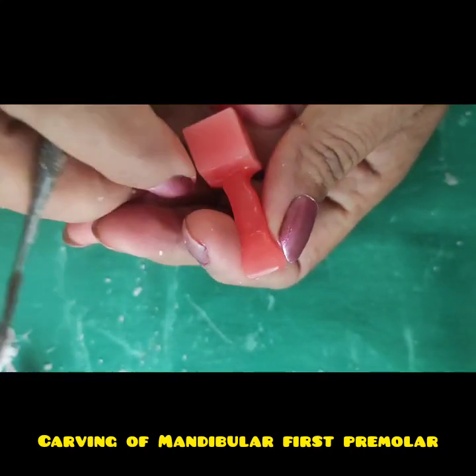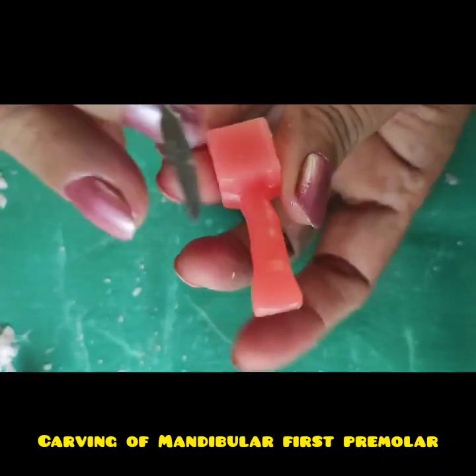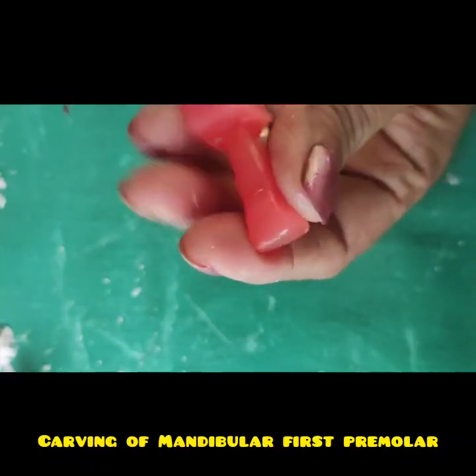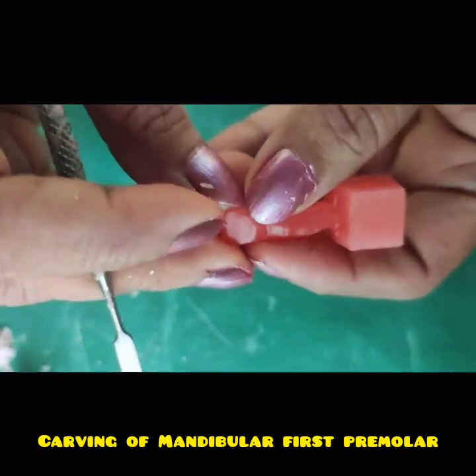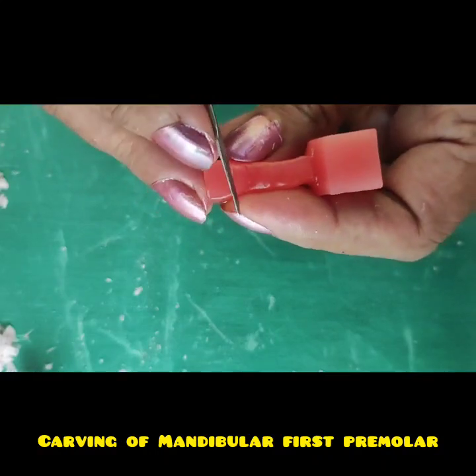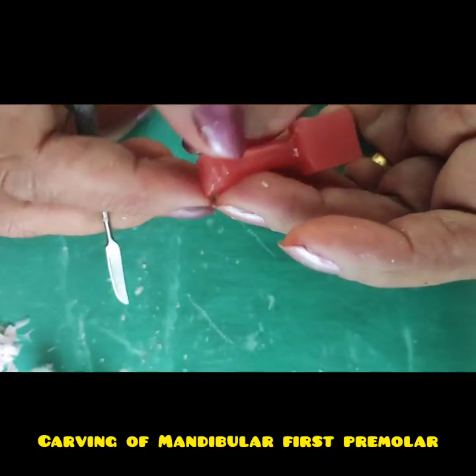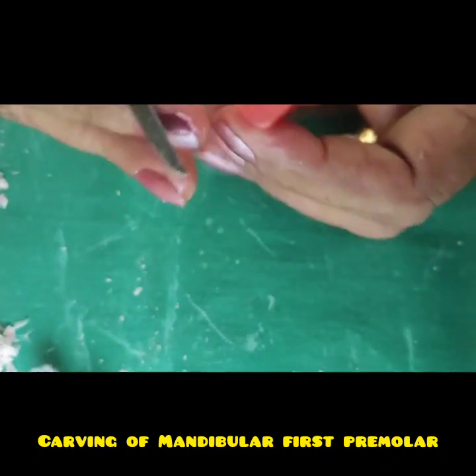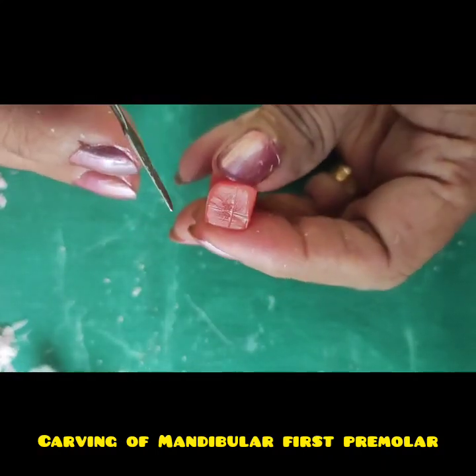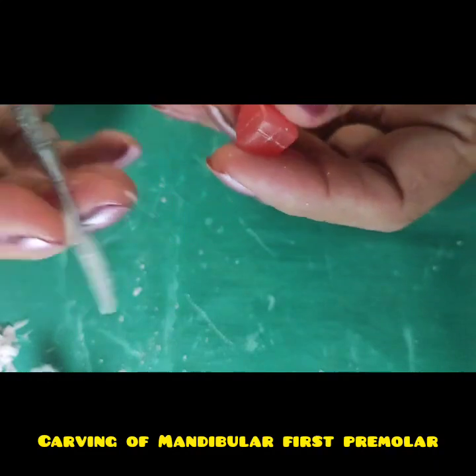So now I am going to show you carving of the mandibular first premolar. In this also I have already carved the root with the distal tilt, and roughly reduced the crown morphology. Same like other carving, I will divide the labial surface into 3 halves vertically, and the palatal also into 3 halves, and then same like other premolars, I will carve the plus sign on top, and if this is my labial surface, I'll reduce till I reach this line.